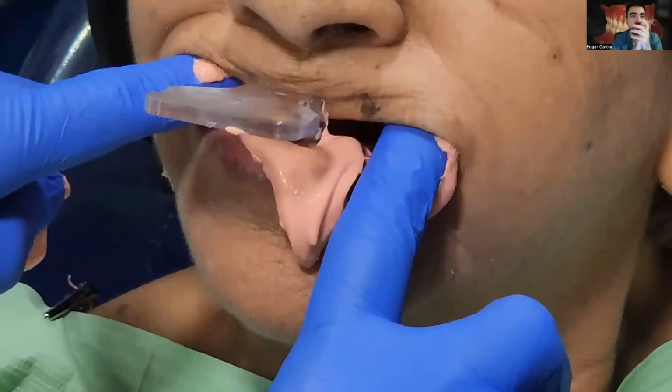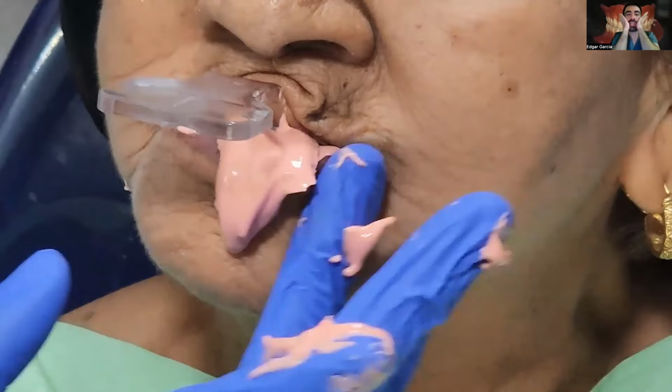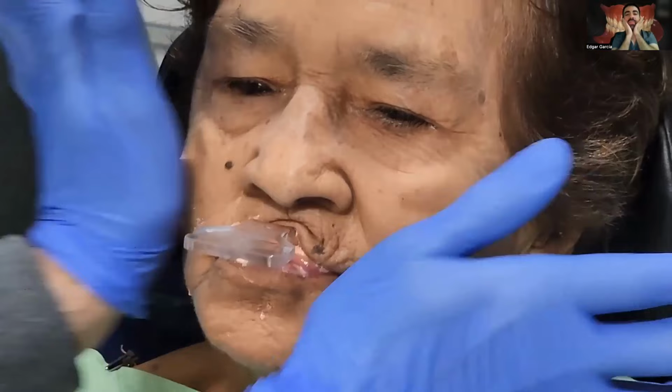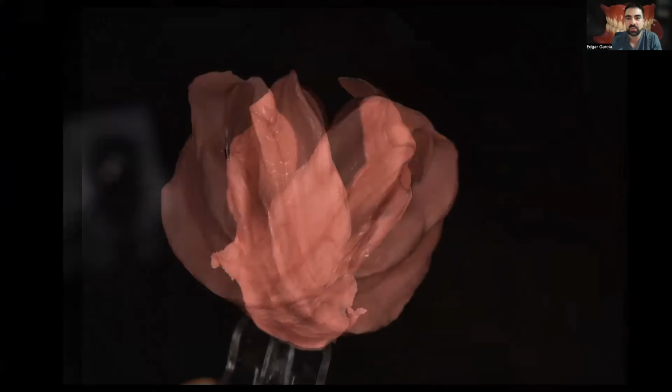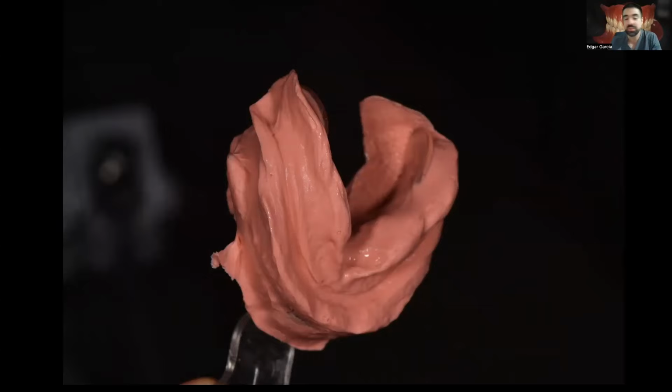We are also going to do this massage upwards, like this, to prevent an excess of material from going through the cheek. And that's it. It's the easiest impression that I have ever taken. The results of this impression are awesome, because as you're going to see, we have all the information that we want. Look, it's a beautiful but, most important, easy impression. It's super easy, this impression.